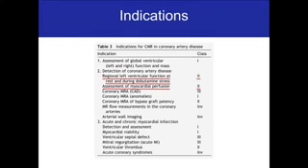In fact, the regional left ventricular function at rest and during dobutamine stress can help detect coronary artery disease, or alternatively, the assessment of myocardial perfusion. Both got a class 2 indication, so they're perfectly sound tests, but there are other tests that can also give you that information, and we'll come back to that in a little while.